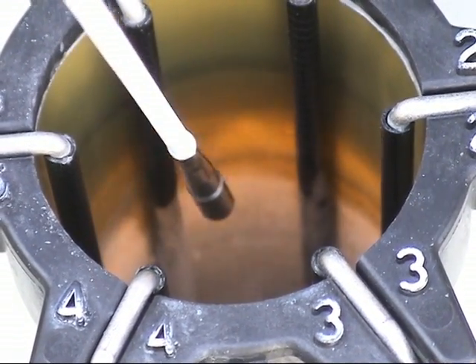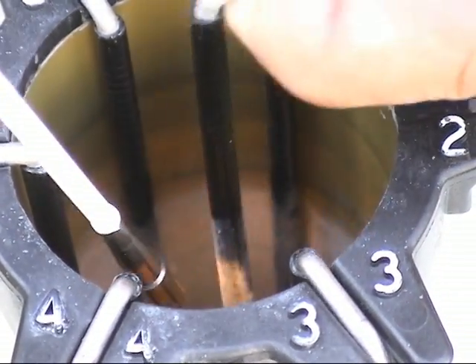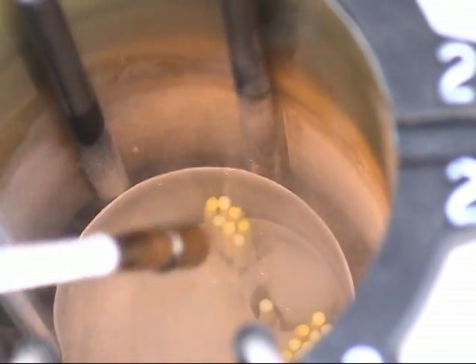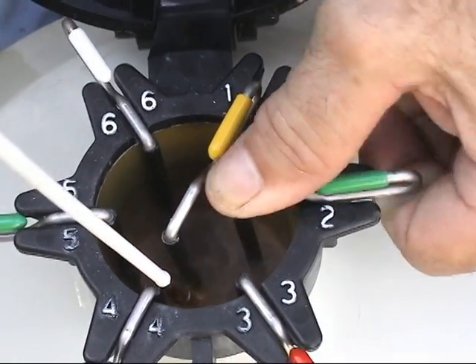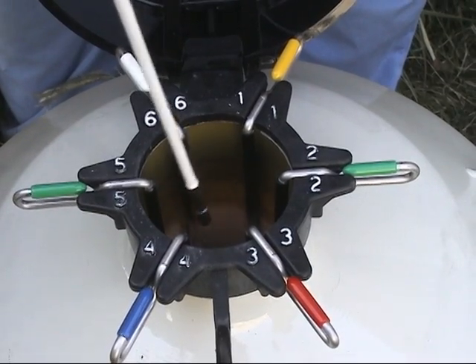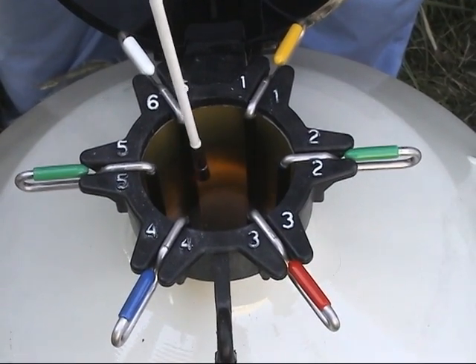You want to work on the semen below the frost line so none of it thaws when you are removing it from the tank. Looking closely at a canister pulled up and kept below the frost line, you can see the straws of semen stored there. Always keep enough nitrogen in the tank so that the straws remain frozen for an extended period. As long as you have nitrogen and a visible frost line, your semen should remain viable indefinitely.